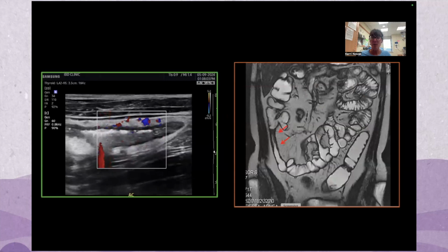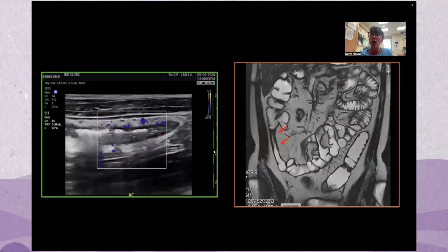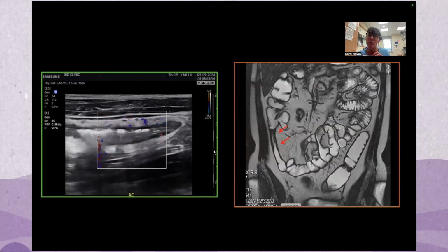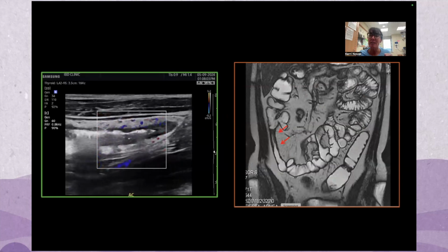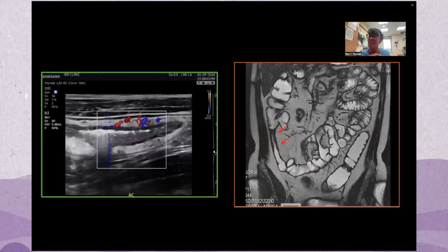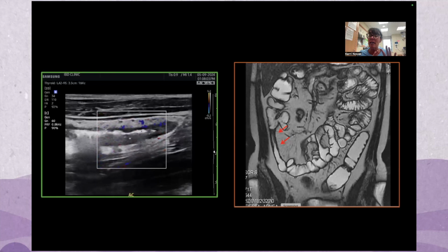Here's another example. This is an ultrasound image of the ascending colon. You can see the wall is very thick. It looks white because it's chronically inflamed. Sometimes this occurs and we can't get any farther because the scope loops, or we have difficulty getting into the terminal ileum for all sorts of reasons. Sometimes it's even narrowed. So you have this image in cross-section of the cecum.